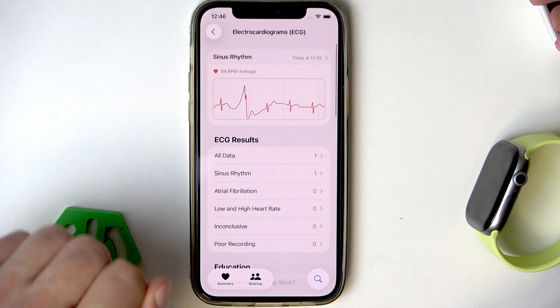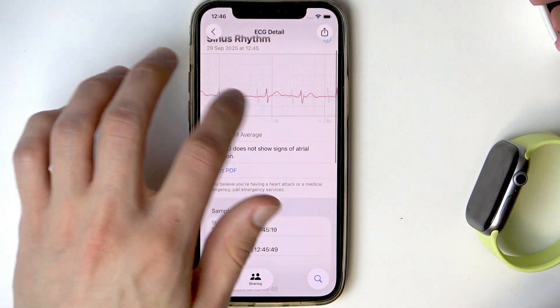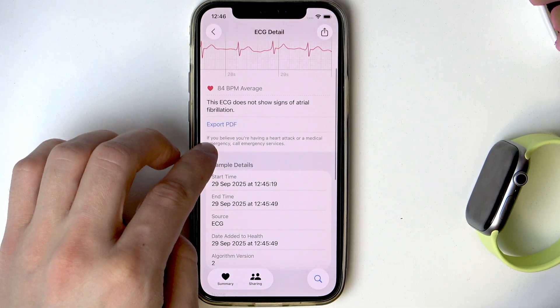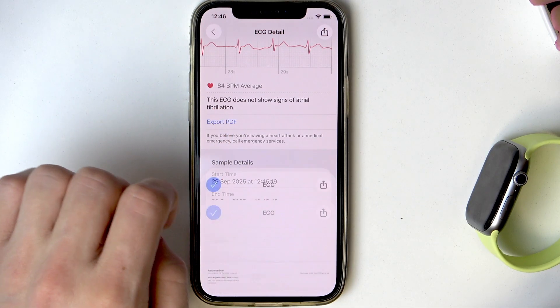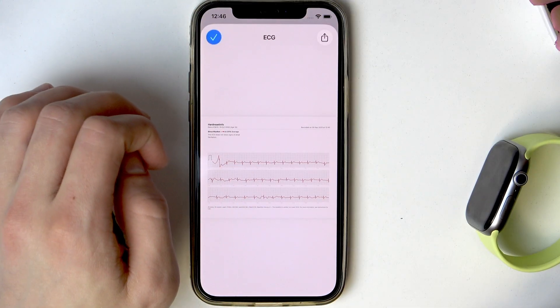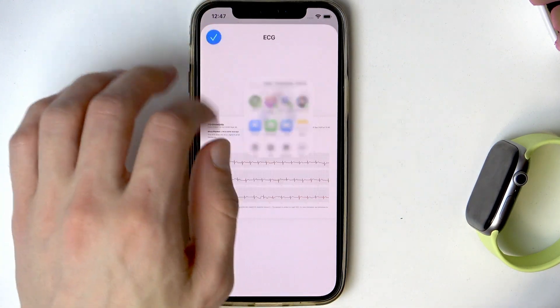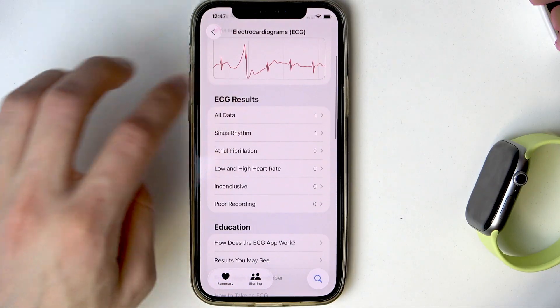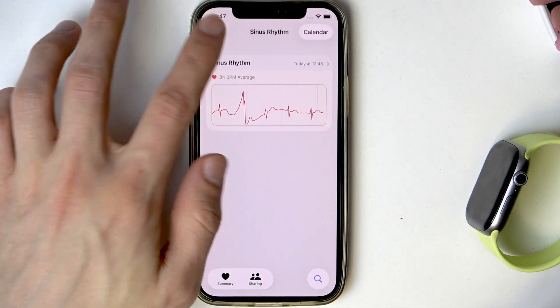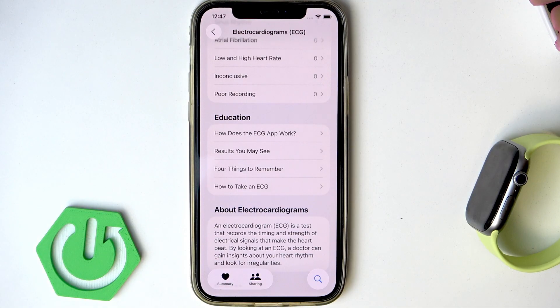Here you can find the full ECG that you just took. You can also export it to PDF by tapping this option and then sharing the file wherever you need to. You can also check previous results of your ECGs and compare them.